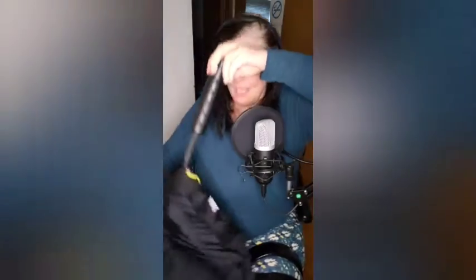And so every time that you're going up and down, in and out, you're risking pinching yourself right here, like that. So you have to hold just on the very edge of this, which is not easy. And it's just these few back and forth strokes. My arm is hurting. And it's still flat. So this has to be done hundreds and hundreds of times to go from flat to not flat. And we can't find the leak in this particular cushion.